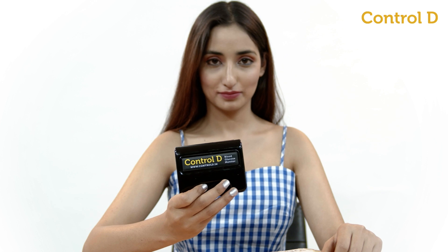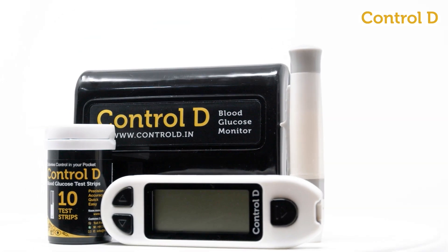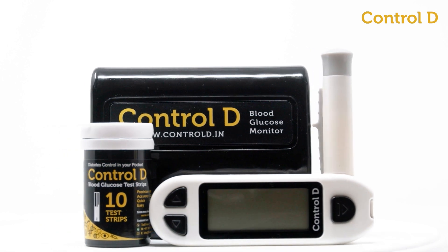Introducing Control D Blood Glucose Monitor, a simple, accurate, and portable device to measure your blood glucose levels.